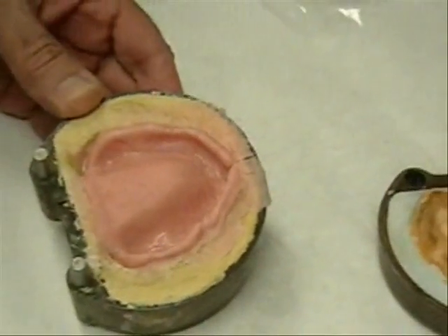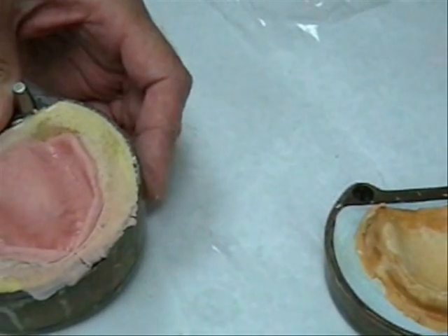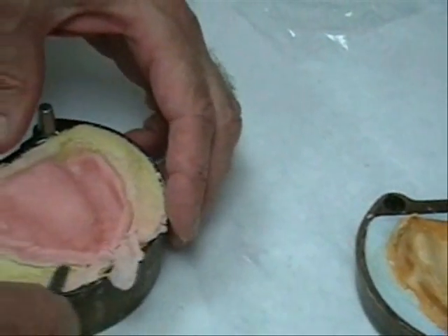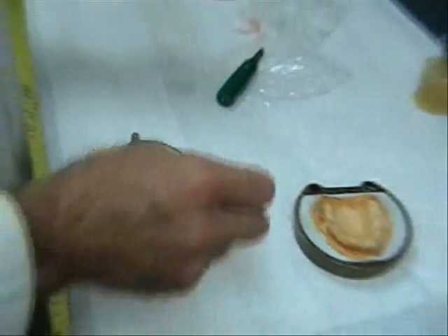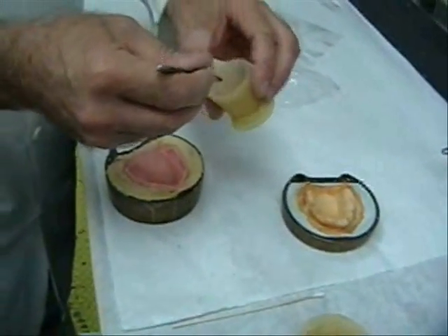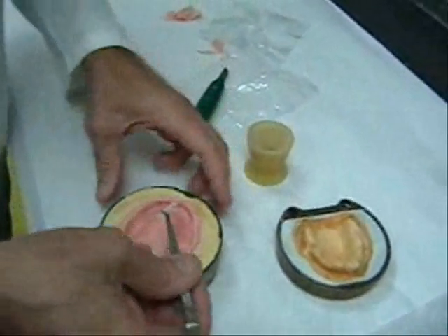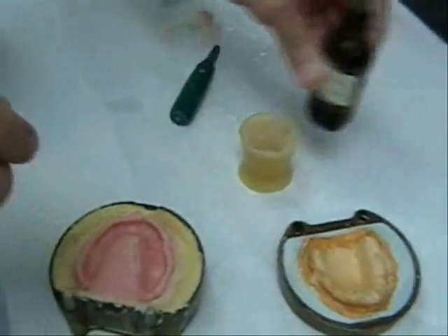Excess acrylic resin is again removed prior to final flask closure. The Texas Dental Practice Acts require patient identification to be placed in removable prostheses; therefore, the patient's name is incorporated into the denture base as illustrated.